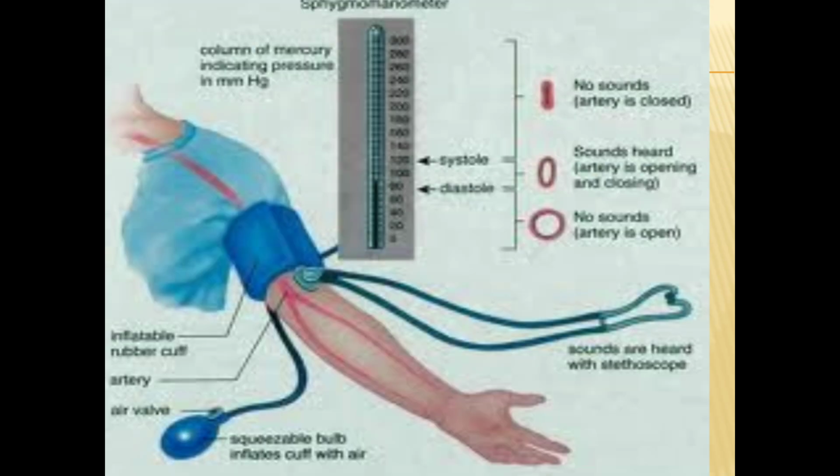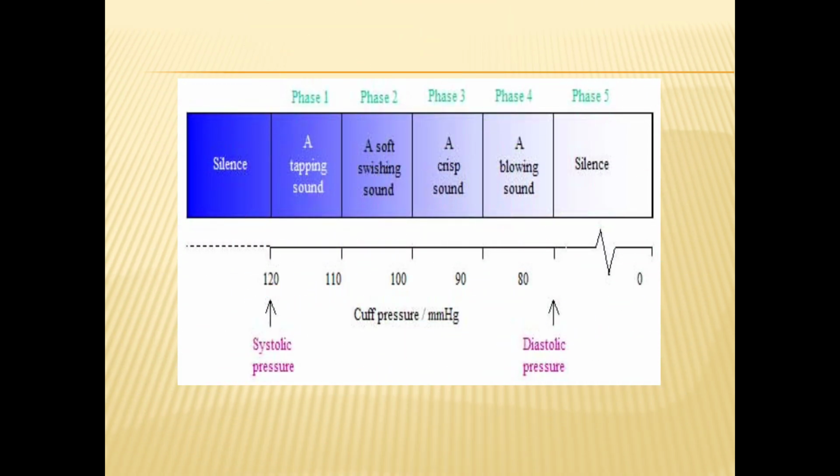These are various criteria as depicted in the picture, and the phases of the sound through which we can listen to the systolic and diastolic blood pressure.